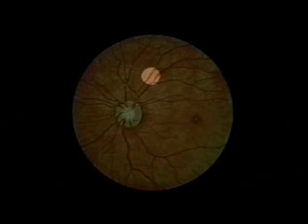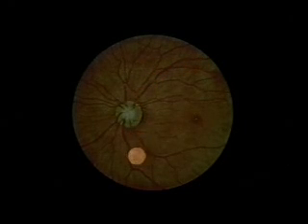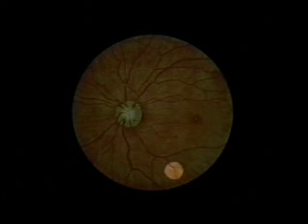Examine the surrounding retina for hemorrhages or exudates, noting their size, shape, color, and distribution. Again, there should be none.